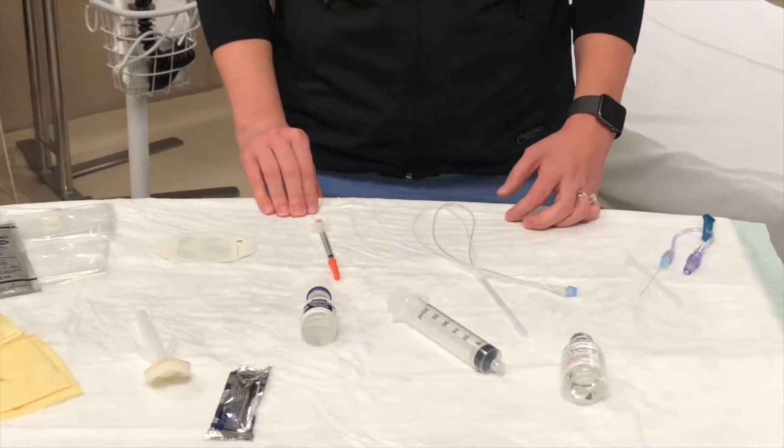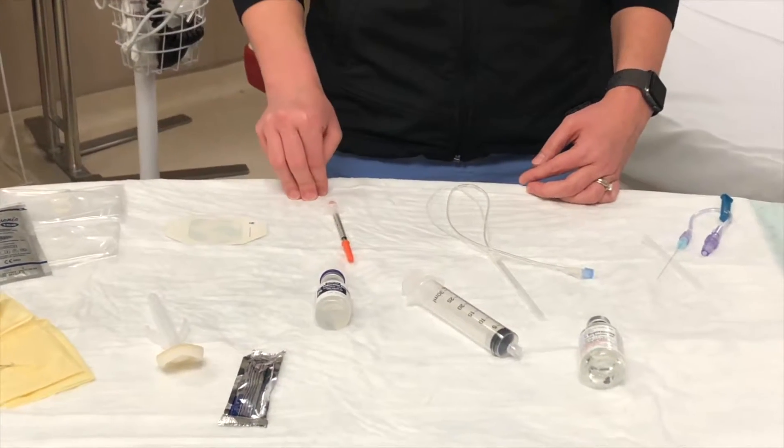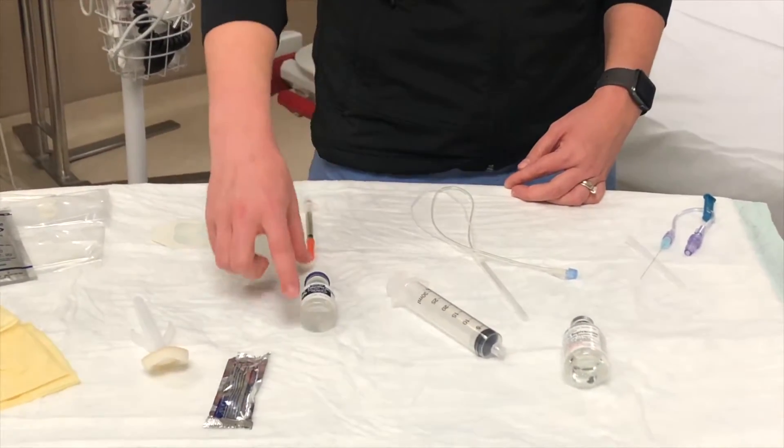Next, you'll need supplies for anesthetizing the patient's skin. We use a small gauge needle such as an insulin syringe and lidocaine.